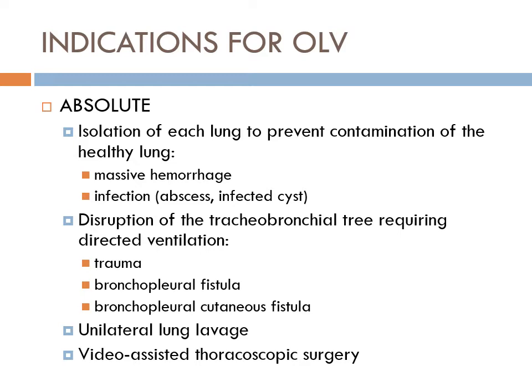Here's your balloon, and we just said we inflate the cuff. So how many centimeters of water? 15 to 20? Yeah, good. What kind of device measures that? A manometer? So you can have one. I've seen some CRNAs have their own. They're terribly expensive for what they are, so I refuse to buy one.